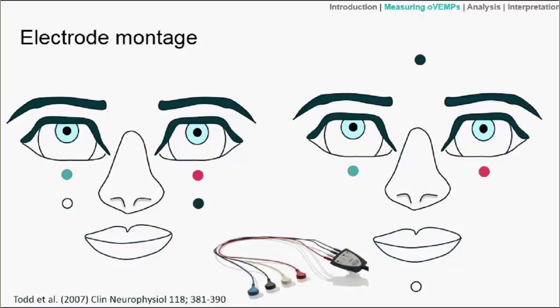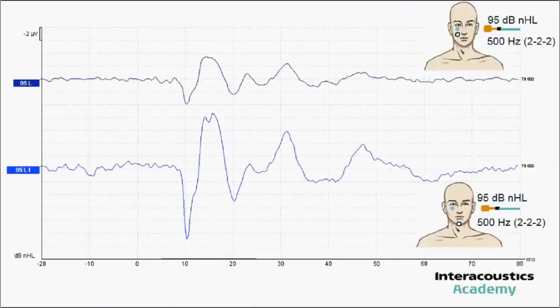What that will do is that now there'll be less attenuation of any of those far field responses, but of course it should also mean that there's less attenuation of the VEMP too, the actual response of interest. And so in this way you might argue it's somewhat more of an elegant solution, but at the expense of some purity, because we'd expect some unwanted responses to creep into the measurements now. And so that's illustrated on this slide here.